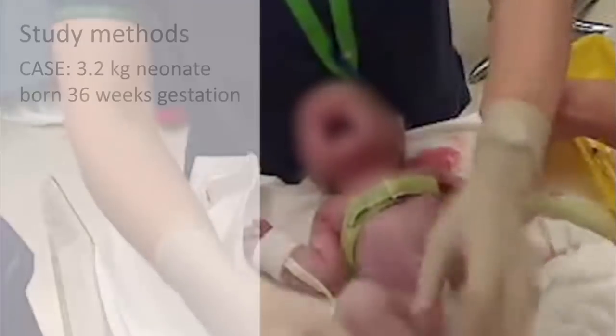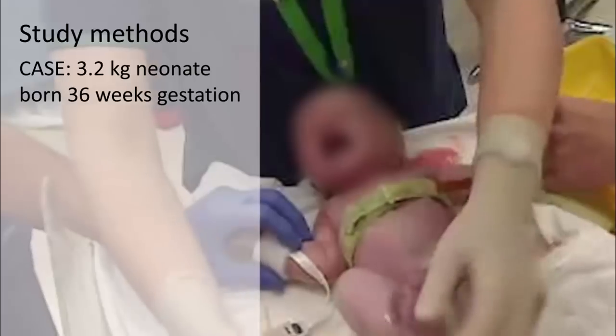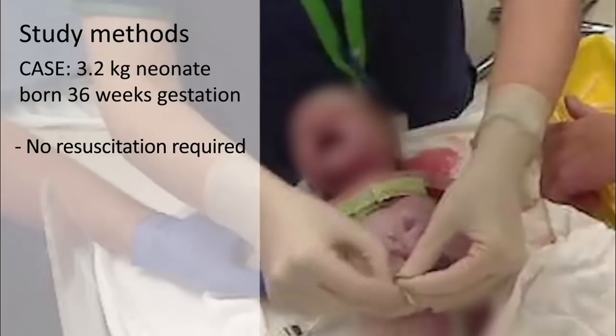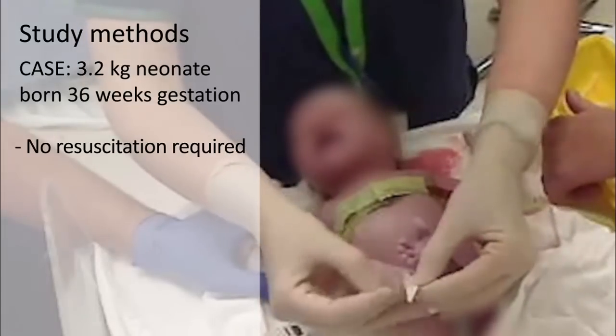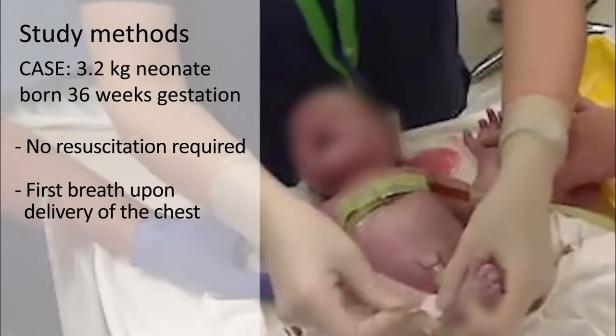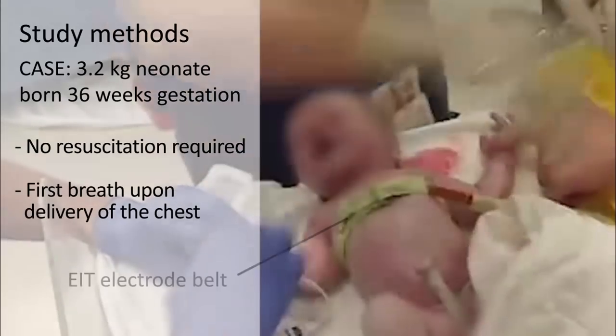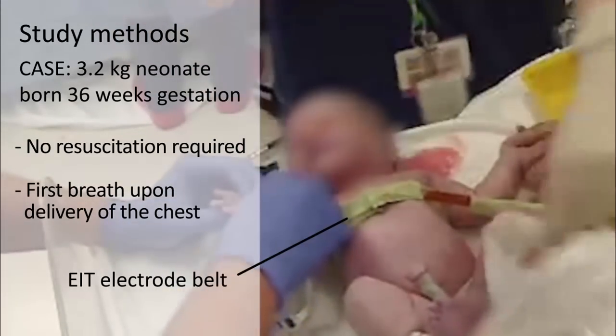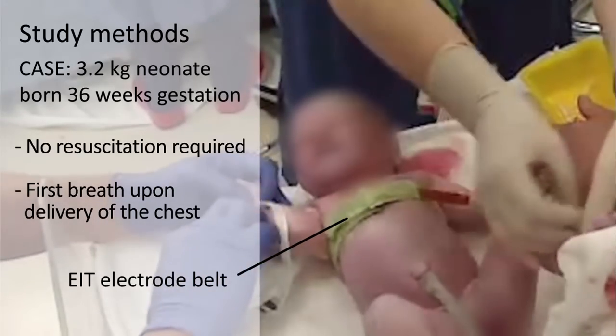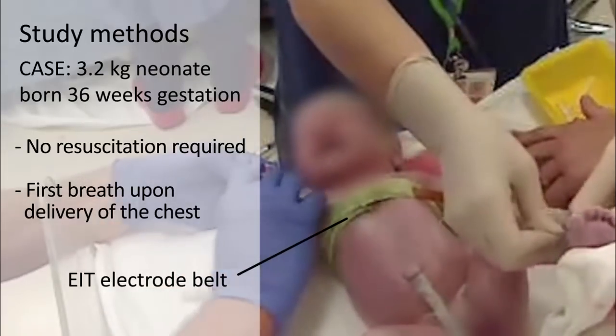Here the study methods can be seen in a 36-week gestation neonate who did not require any resuscitative interventions at birth. The first breath occurred on delivery of the chest. As the neonate was placed on the resuscitaire, a custom-built non-adhesive EIT electrode belt was placed around the chest and imaging immediately commenced. In this case imaging began at 22 seconds and continued for the first six minutes.